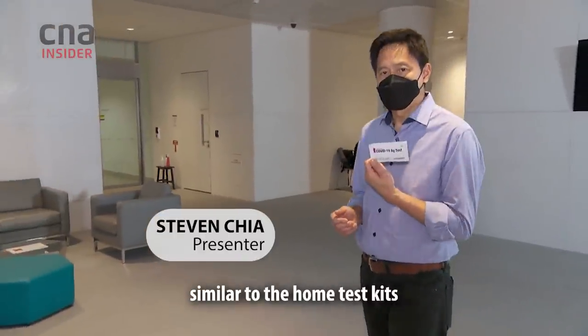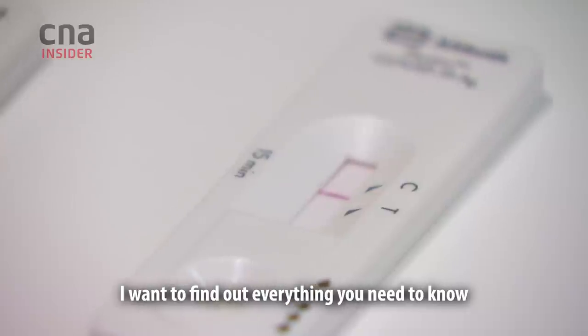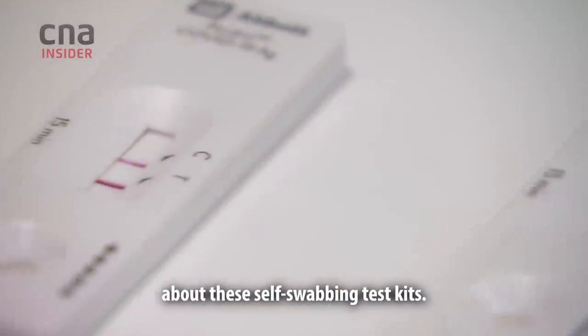This is an antigen rapid test kit, similar to the home test kits you might buy off the shelf in a pharmacy. I want to find out everything you need to know about these self-swabbing test kits.